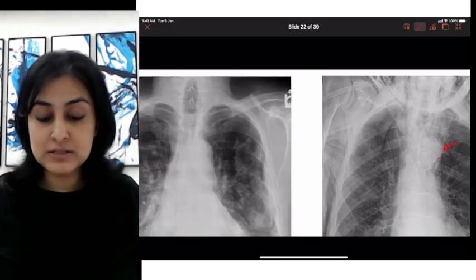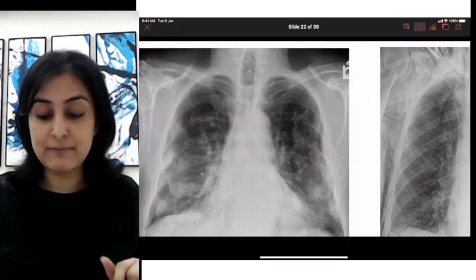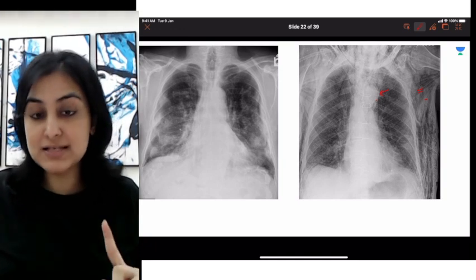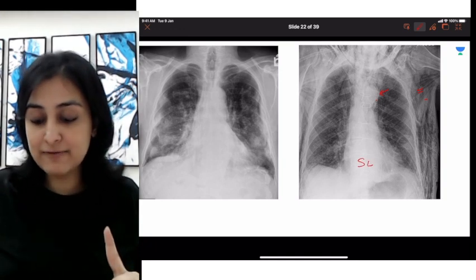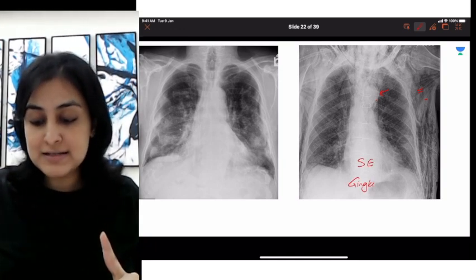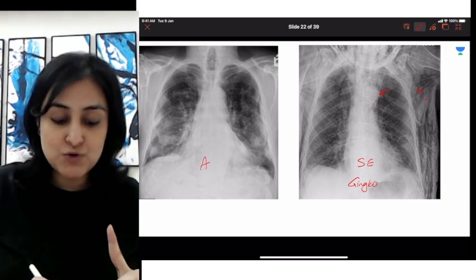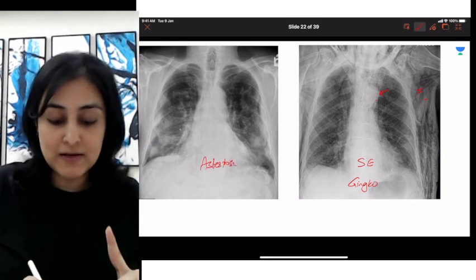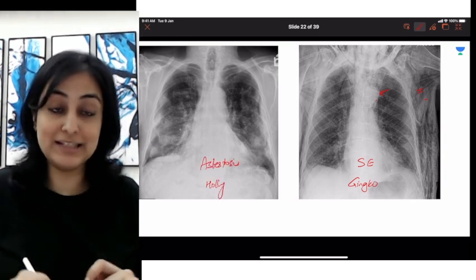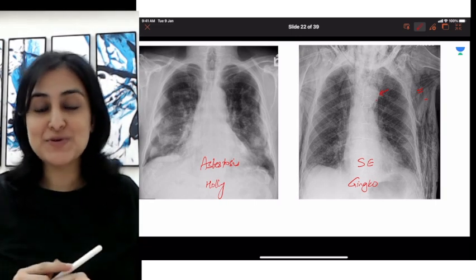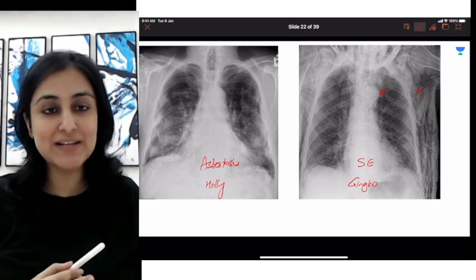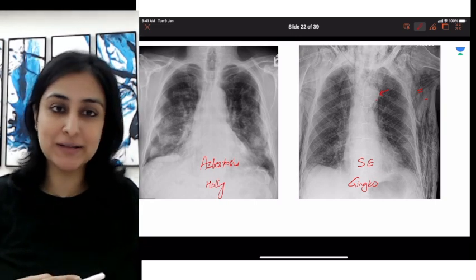To summarize: subcutaneous emphysema corresponds to the ginkgo leaf sign, while asbestosis with calcified pleural plaques corresponds to the holly leaf sign. This was what I had in this short video. I will see you very soon with the next one. Thank you.